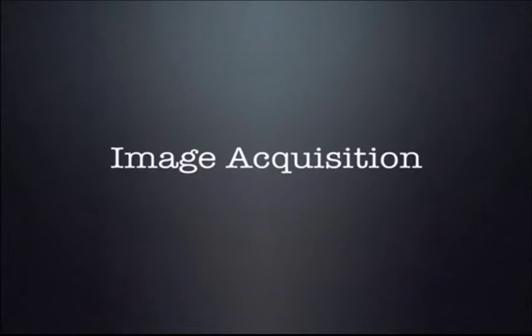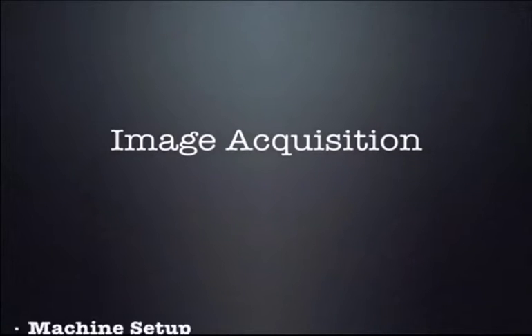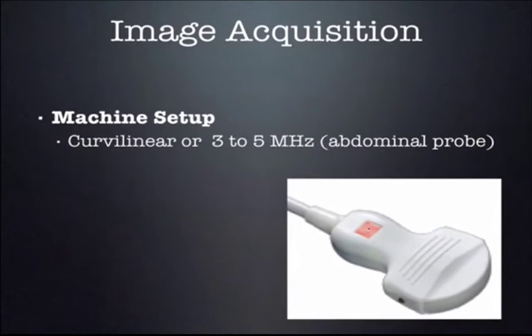So let's start basic and let's talk about how to actually get images of the aorta. Your probe selection most commonly is going to be the abdominal probe or curvilinear probe. Now, if you were in a pinch and you didn't have access to the abdominal probe, you could use the phased array probe to do this exam, but honestly, the abdominal probe is the ideal probe to get the best images.